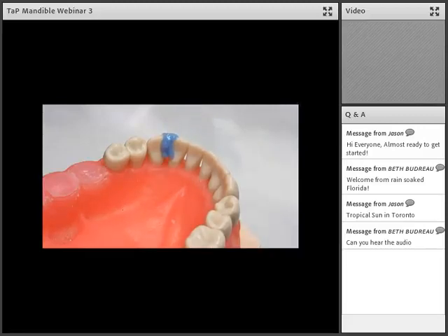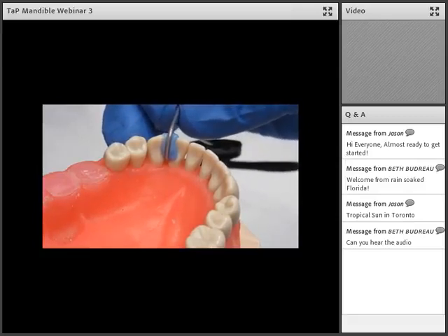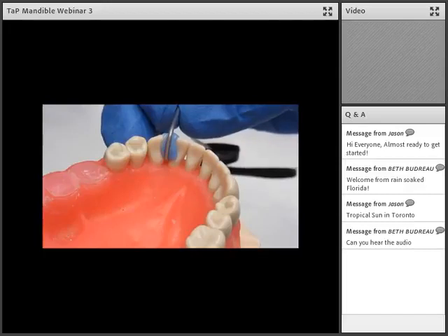I now place the bent 6 mm part of the wire in the composite material, so it comes in contact with the lingual side of the teeth, while aligned in parallel with the tooth length axis, with the rest of the wire crossing over the incisal edge, or the embrasure in this case. I light cure for about 20 seconds, while holding the wire steady in its place.